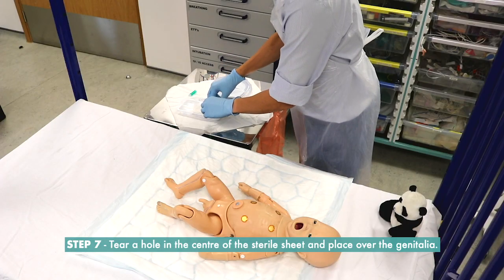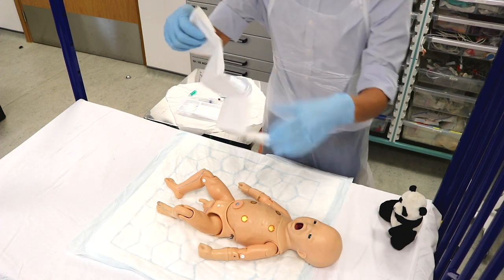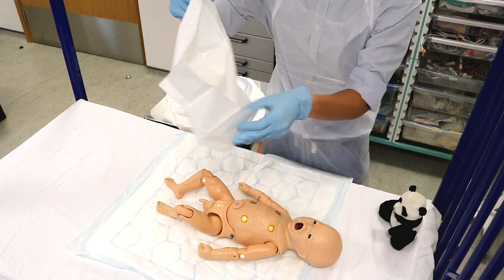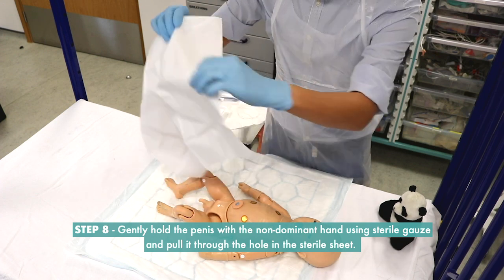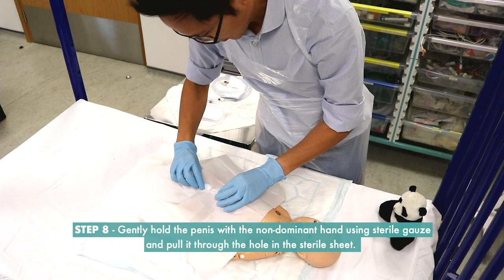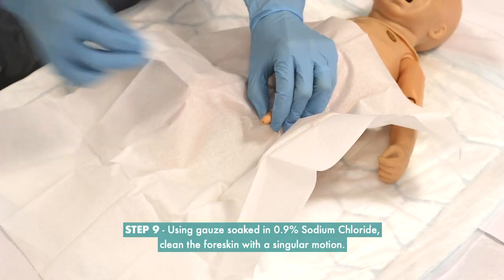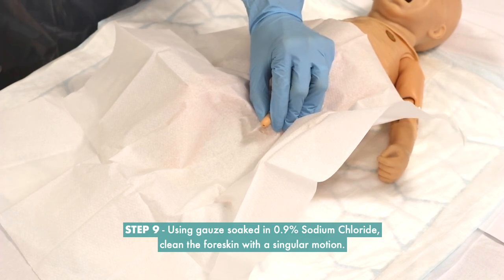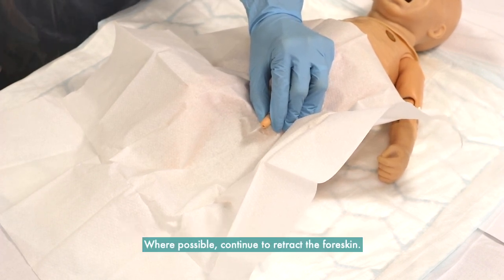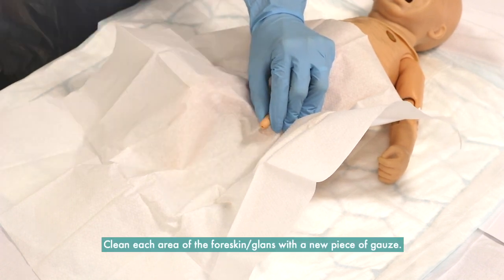Step 7: Tear a hole in the center of the sterile sheet and place it over the genitalia. Step 8: Gently hold the penis with the non-dominant hand using sterile gauze and pull it through the hole in the sterile sheet. Hold the penis vertically and prepare to clean it. Step 9: Using gauze soaked in 0.9% sodium chloride, clean the foreskin with a singular motion. Where possible, continue to retract the foreskin and clean each area of the foreskin and glans with a new piece of gauze.